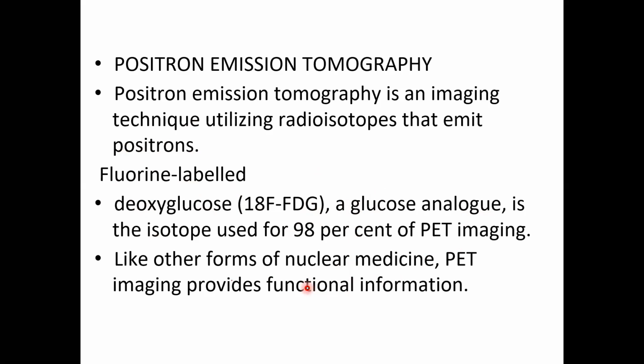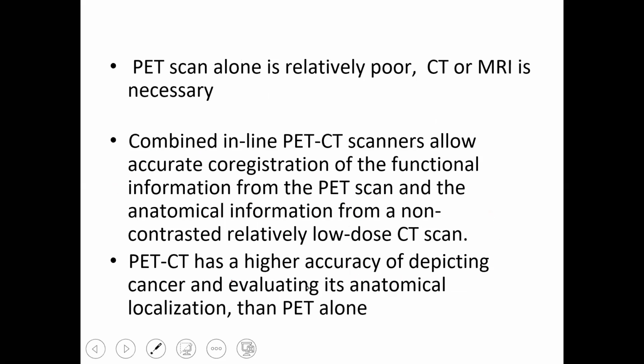Along with PET, if you are doing the CT scan, it is called PET-CT. Along with PET, if you are doing MRI, it is PET-MRI. You can just say that it helps in function. PET scan alone is relatively poor; CT or MRI is necessary.